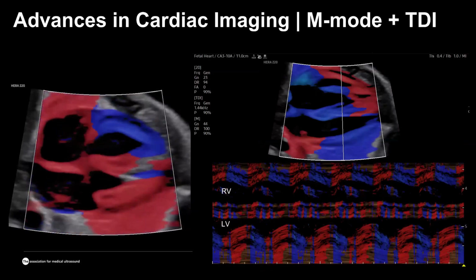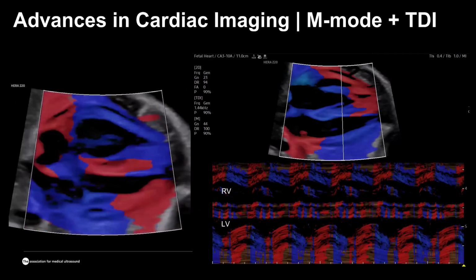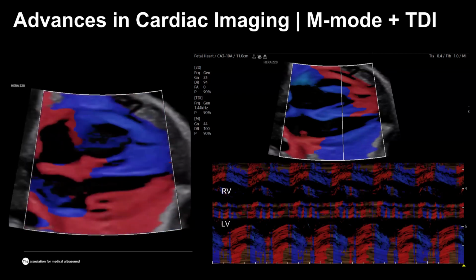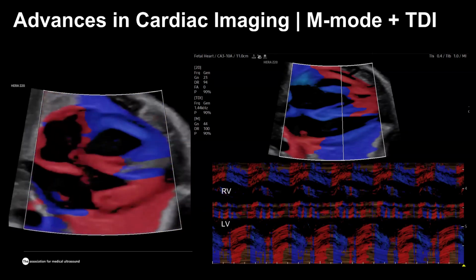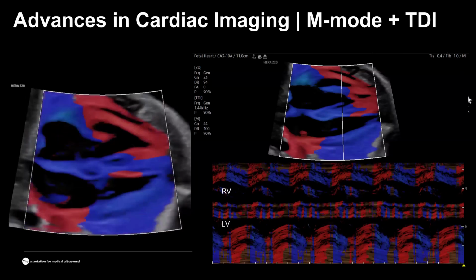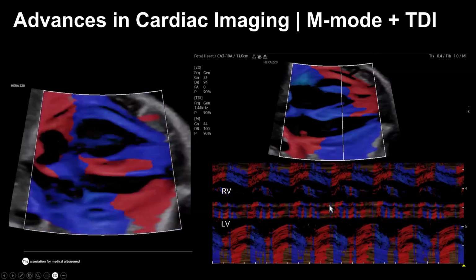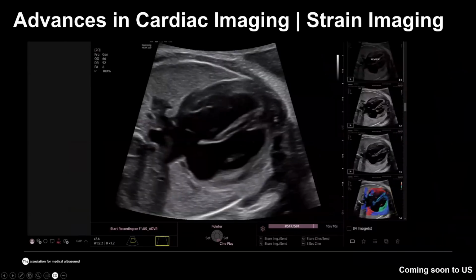But if you have a task to look at the cardiac function, the main limitation of the M mode is the impossibility to find the specific spot where the systole ends and diastole begins. That's why you can use the combination of the M mode and the tissue Doppler, and you will solve this problem, because the change in color will specifically indicate the time where you need to perform the measurement of the walls and myocardium of the interventricular septum.